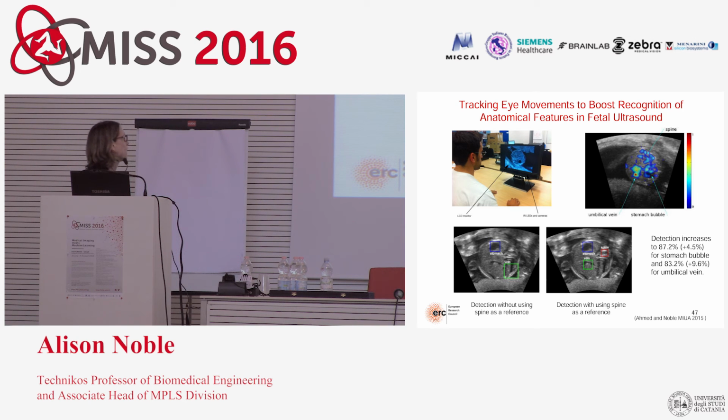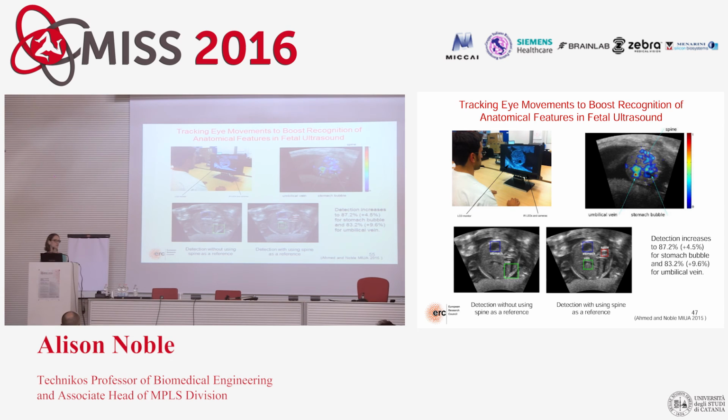And what we've gone back to do is try and understand more why sonographers do better than computers. One way you can do that is by using the information they haven't told us about today. They'll look at images, they'll tell you what they've seen, but they will not tell you where their eyes have looked.